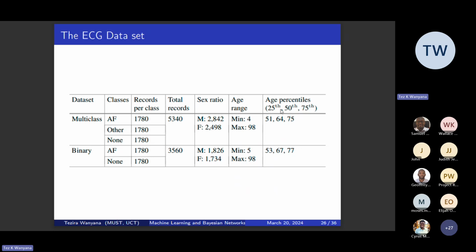And so, like I said, we had these two demographics, in addition to the statistical features. The statistical features that we used were mainly mean, standard deviation, variance, kurtosis, skewness, and maybe one that I've forgotten. We obtained those statistical features for the RR intervals that I described earlier in the ECG, and also for the R peaks. And then we also obtained the root mean square for each of the channels, each of the leads.